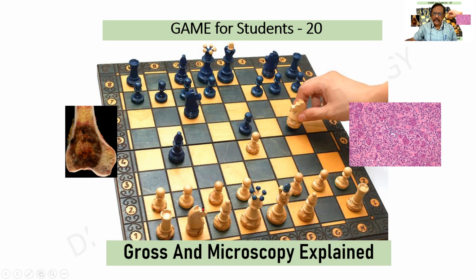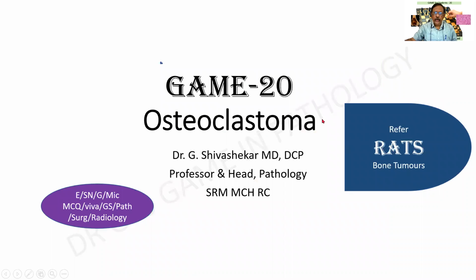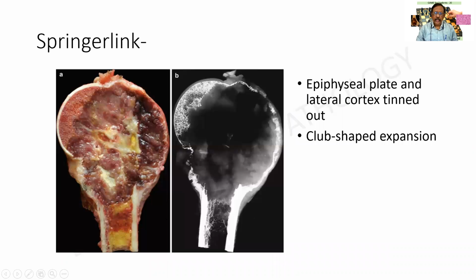In today's lesson, we shall be covering osteoclastoma, the details of which can be referred to in the textbook, and the importance is given in the enclosure. We shall be restricting ourselves to the gross, radiological, and the microscopic findings.